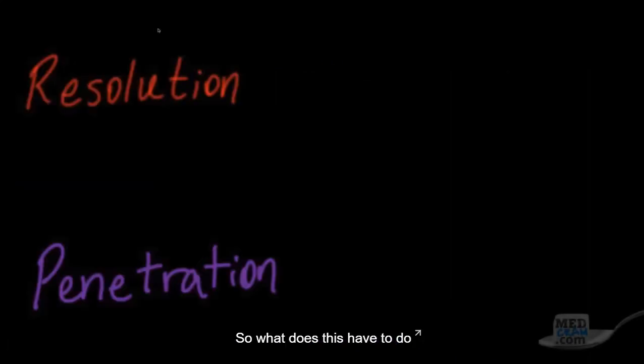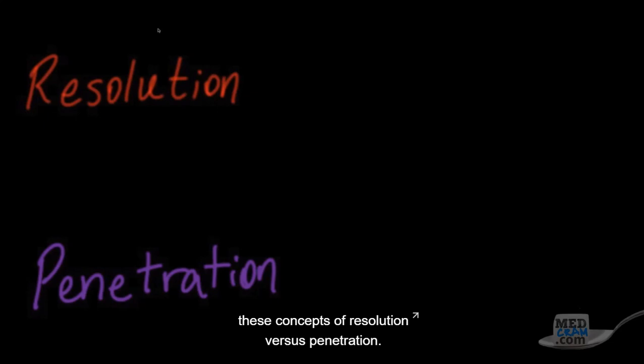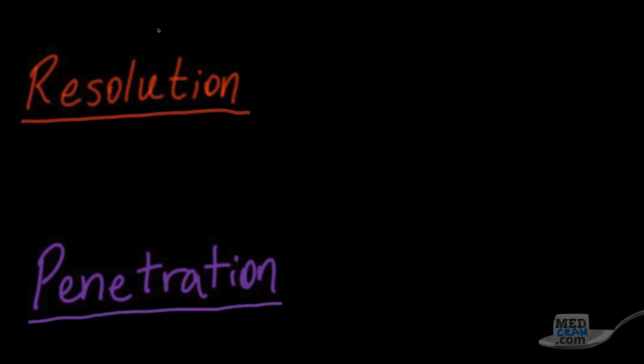So what does this have to do with diagnostic medical ultrasound? Well, it primarily boils down to these concepts of resolution versus penetration. Now, resolution simply is how pretty your picture is, how defined and detailed the ultrasound image is. Penetration simply is how deep the ultrasound wave is able to penetrate into the patient's body and therefore generate an image. And these things are primarily a function of frequency.